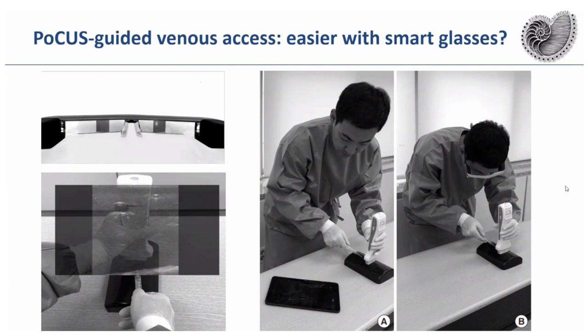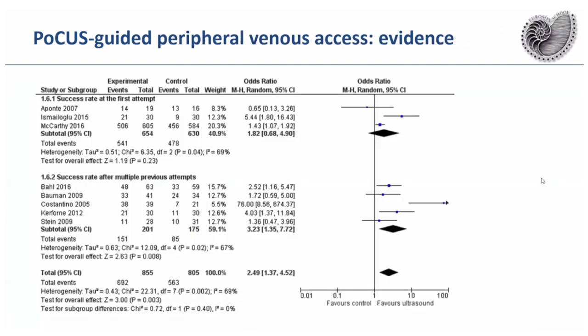I think this is impressive. It works. In this prospective comparative study, it worked not as well as the traditional approach, but I think this is a matter of training. I never used such virtual glasses. And if you have some training, for example, with video games also, I think you will become familiar with this technique in a clinical situation.